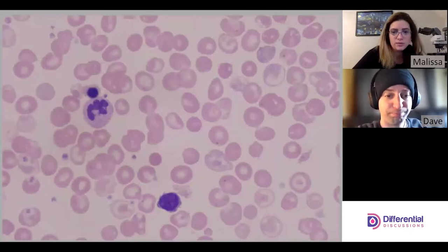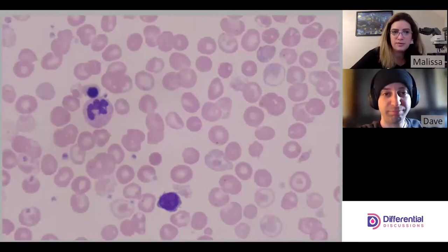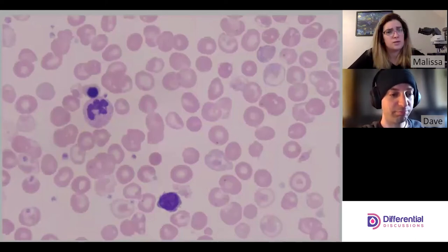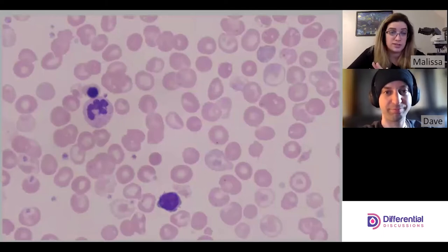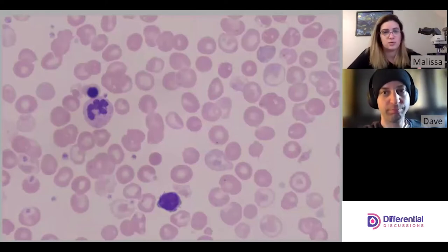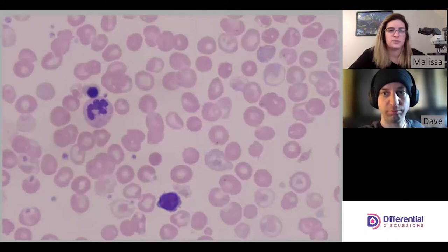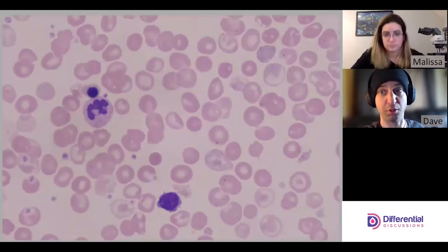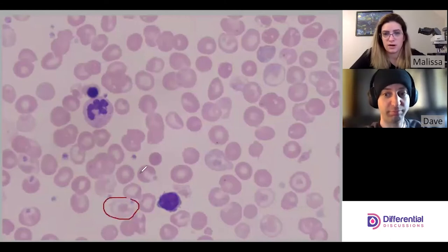Now let's get to the morphology. Because this is a hemoglobinopathy — thalassemias are quantitative hemoglobinopathies and hemoglobin E is both quantitative and qualitative — we're definitely going to have codocytes. Codocytes are present in all hemoglobinopathies, whether thals or sickle cells or any other qualitative or quantitative type. They vary a little in their presentation too.